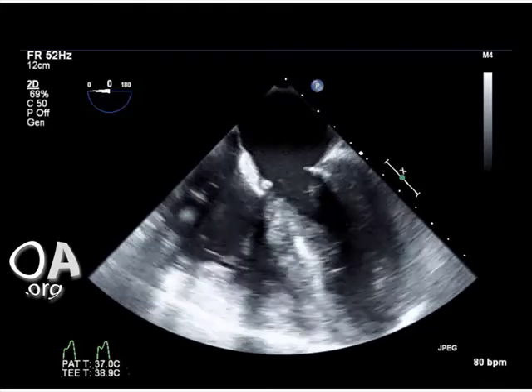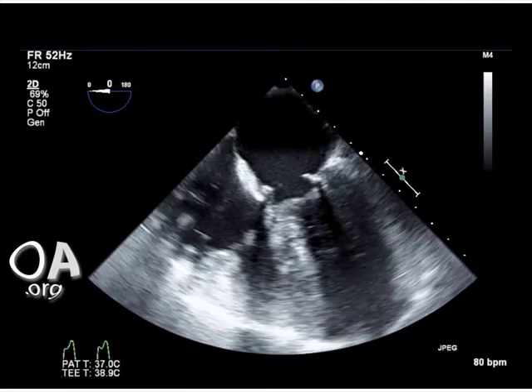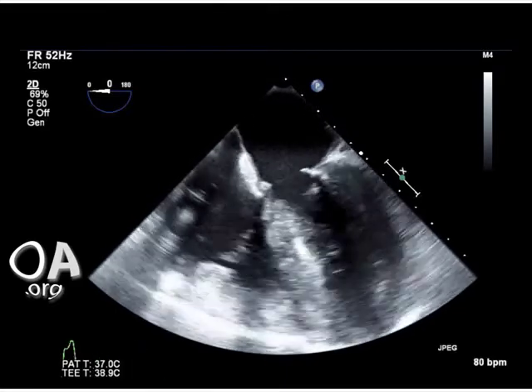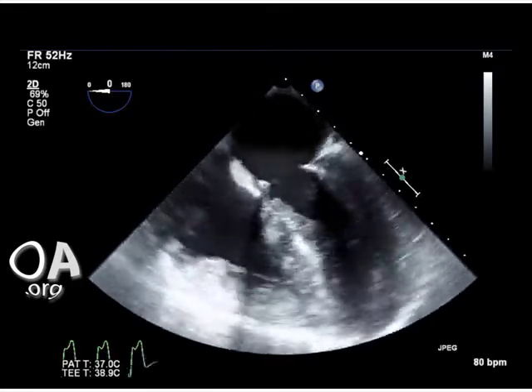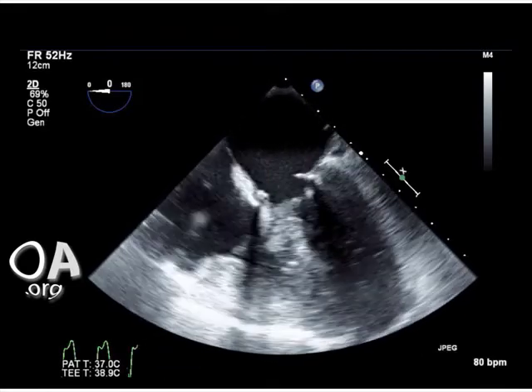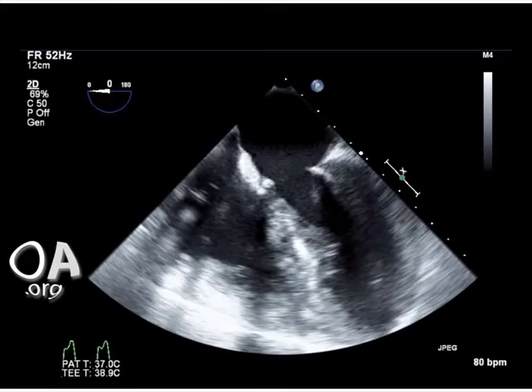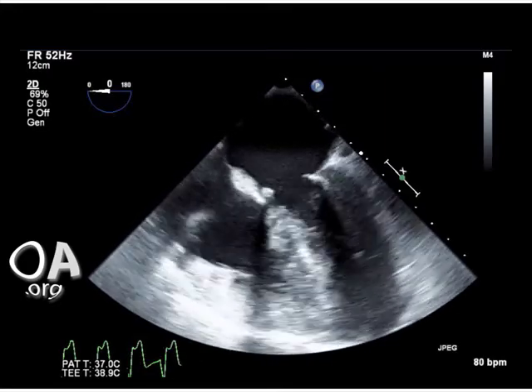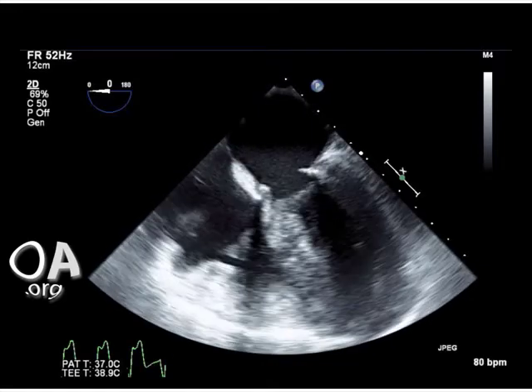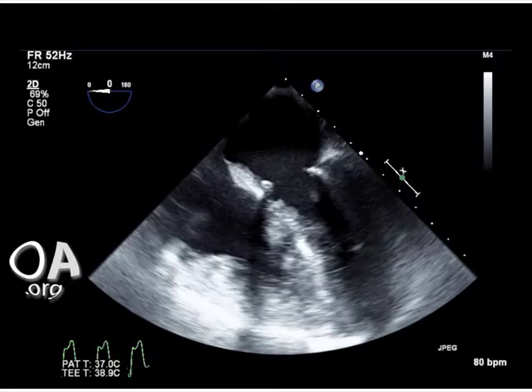For our patient, a significant portion of the hypertrophied septum was resected, and the aortic valve was normal on inspection. Separation from cardiopulmonary bypass was uneventful, although she required some inotropic and vasoconstrictor support due to her pre-existing right ventricular dysfunction and pulmonary hypertension. Here is a post-bypass mid-esophageal four-chamber view. The septum appears less thickened, and the anterior mitral leaflet does not get swept out into the left ventricular outflow tract.